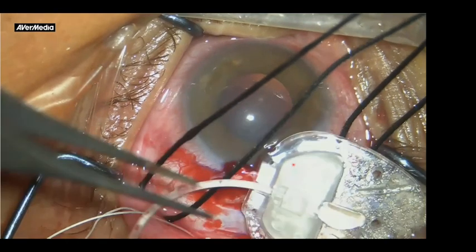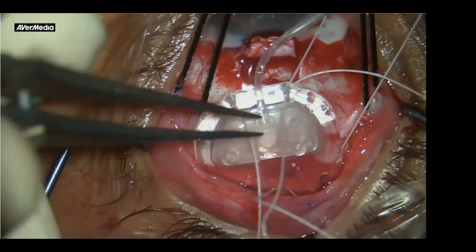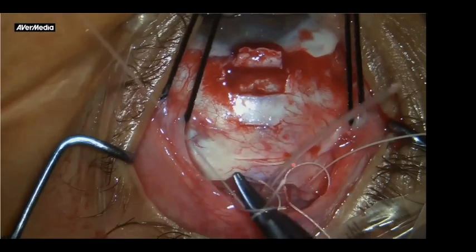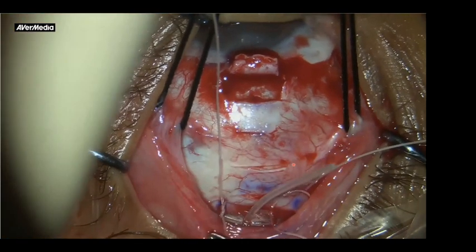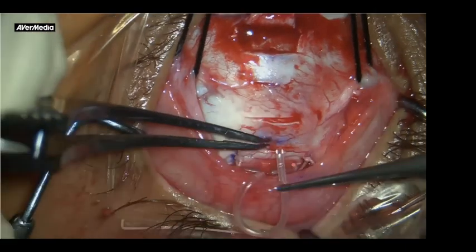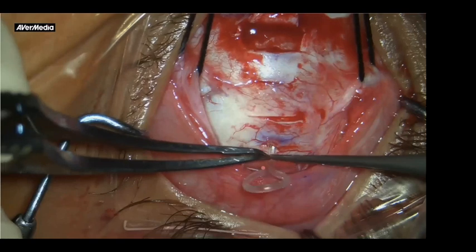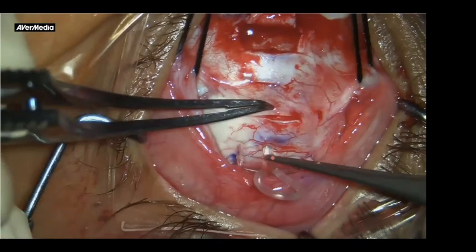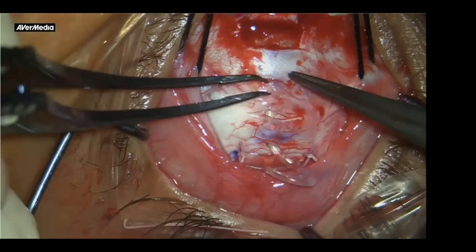And then passing this non-absorbable Ethibond 5-0. You can use nylon 8-0 or 9-0 as well. And then holding the tube, it's very important. If the tube is long, you will not be able to hold it. So take a short part of the tube and make it very beveled. And then you can move it through the tunnel. And then once you get it, you will push it into the second tunnel.